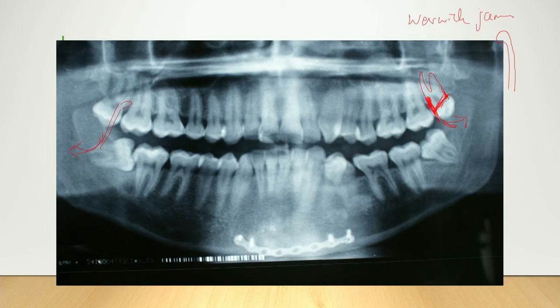If you really can't see, then I'd do a flap. So my flap would be a mesial relieving incision, and then just along the gingiva. Raise the flap so you can see. If you have to, then remove some buccal bone, but very rarely do you really need to do that to remove an upper wisdom tooth. You really just need to get a good application point on the mesial there. So hope that answers your question.